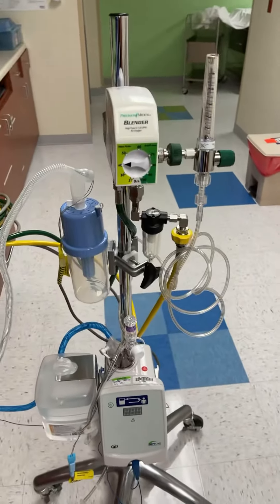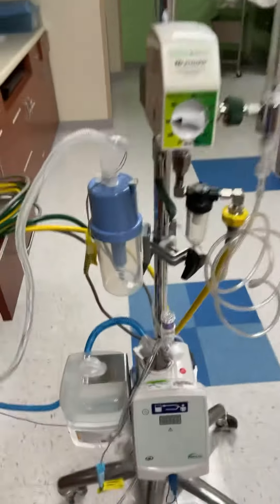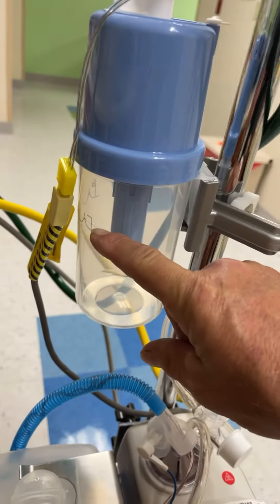Today's video is on how to set up a bubble CPAP. It's pretty much the same as a high flow stand, but it has the bubble canister right here that you fill up with water up to this water line, just like a CPAP reservoir.